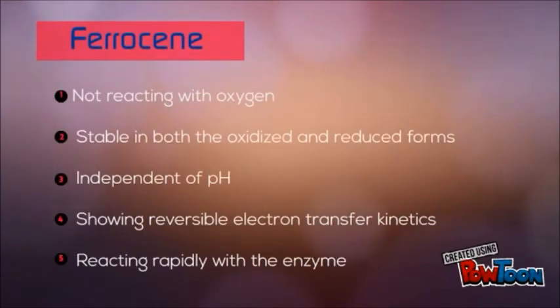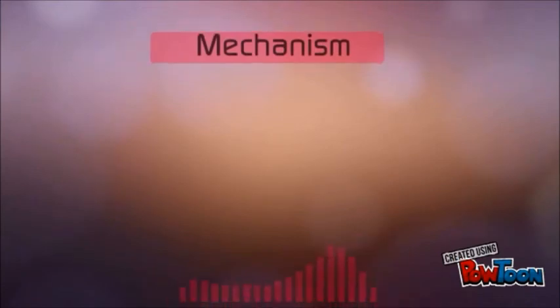Ferrocene fits all criteria for a good mediator: not reacting with oxygen, stable in both the oxidized and reduced form, independent of pH, showing reversible electron transfer kinetics, and reacting rapidly with the enzyme.